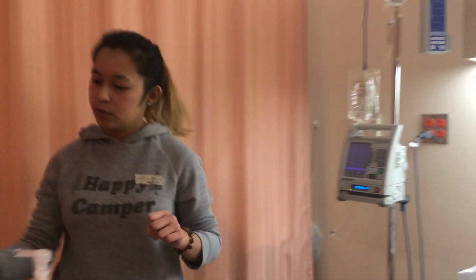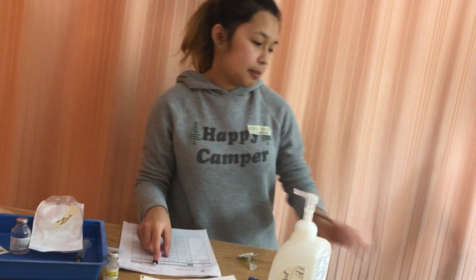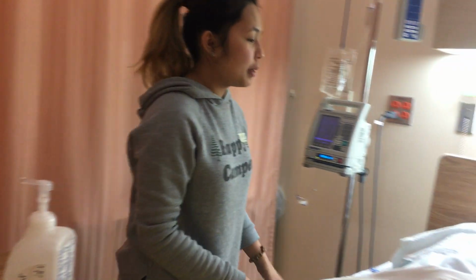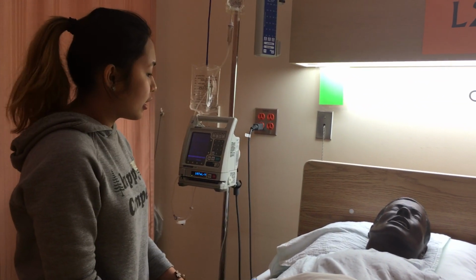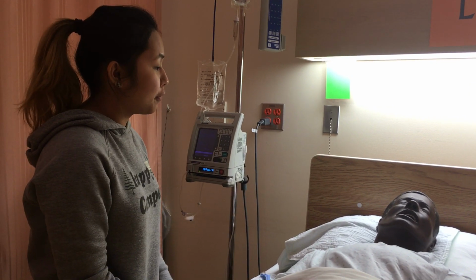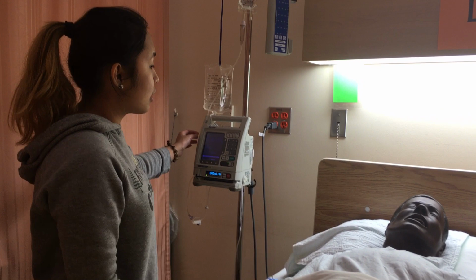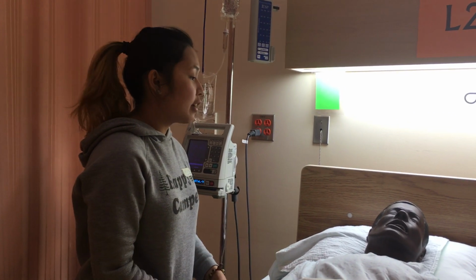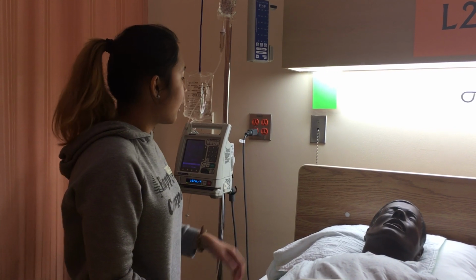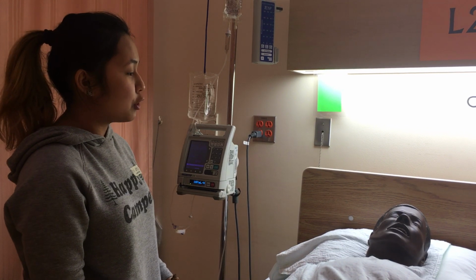And then I'm going to document on my MAR that I've given the medication. And I will let my patient know. Miss Phalange, I'll be back in 15 to 30 minutes to check up on you. Make sure that you're not in distress or you're feeling no pain. And I'm gonna make sure as well that the medication is infusing well. In the meantime, if you're feeling any of the side effects I've discussed with you, I will place the call bell within your reach, and you can just let us know.